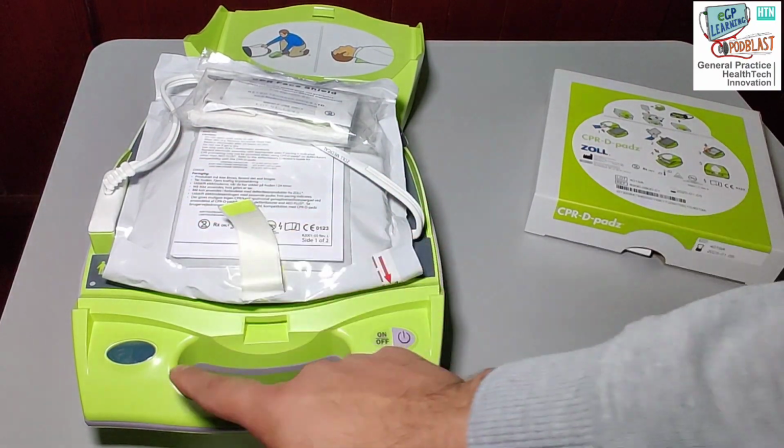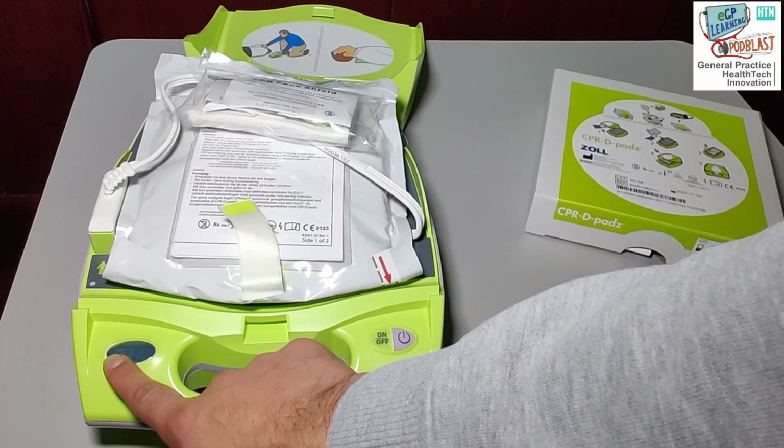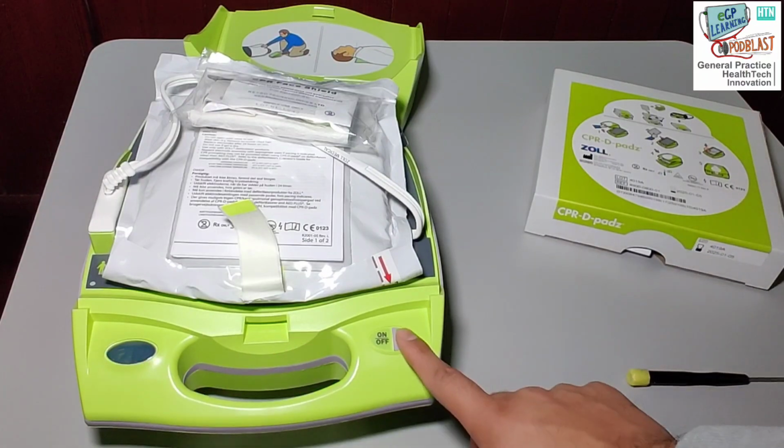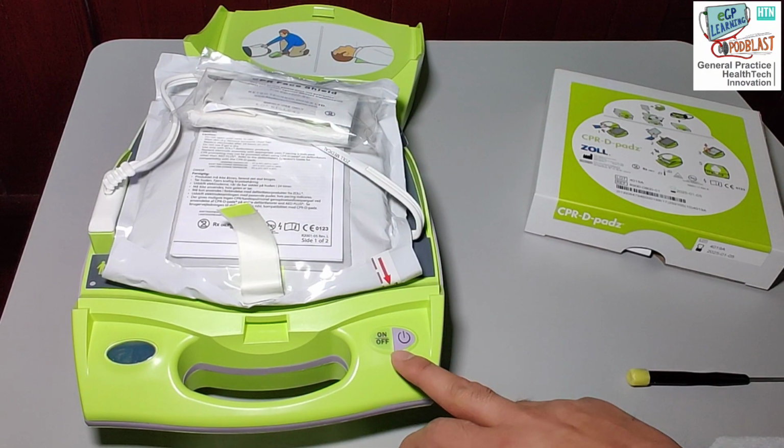Once the pads are in, this light here will change from red to green, and that will mean that the pads are usable. You will need to press the on-off button in order to do so. As you can see, I've already placed the stickers on ours that allow this to be visible.